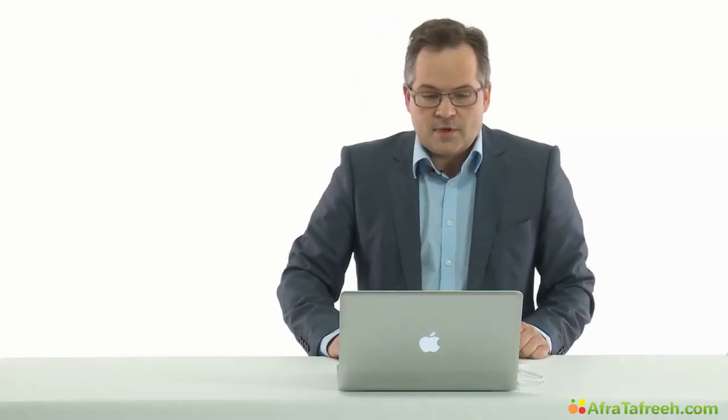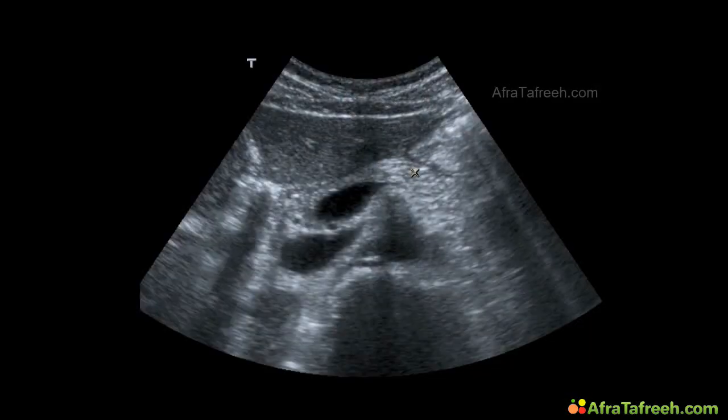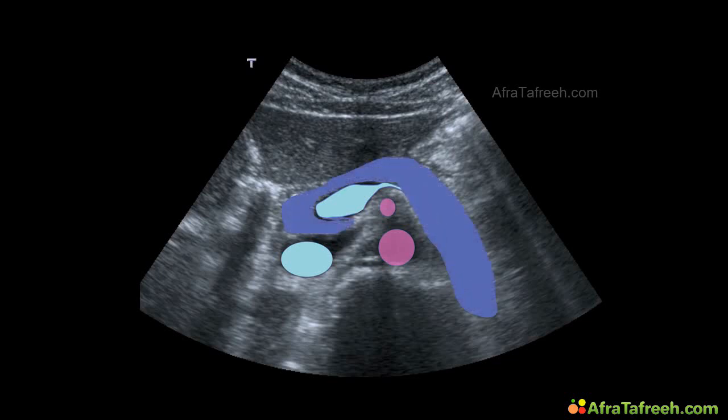So once again, next patient. Another echogenicity of the organ and a slightly different angle of viewing, and we have to look for the landmarks. Where is the splenic vein? It's over here. So where is the IVC? Here. Abdominal aorta, somewhere over there. SMA, superior mesenteric artery. And there's the pancreas. This is the pancreas.